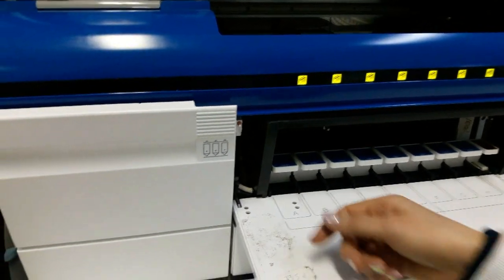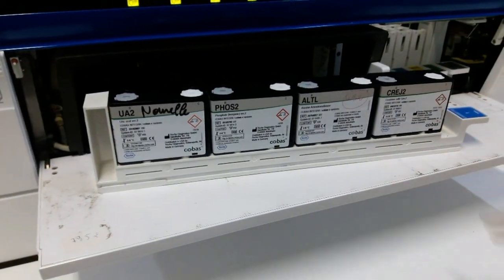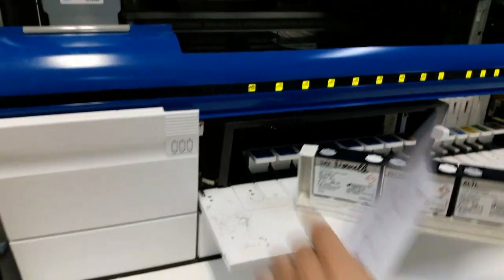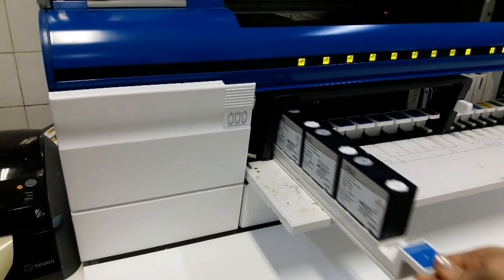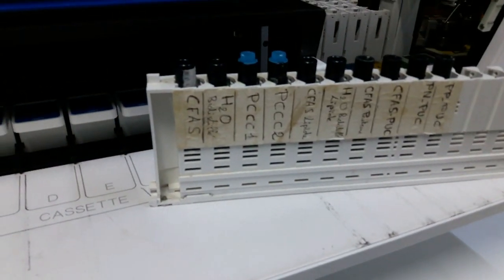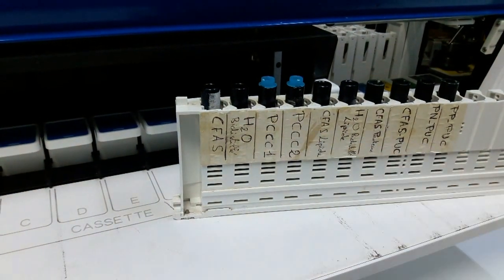Cette partie de l'appareil contient les racks des différents réactifs. Les racks se présentent ainsi. Par exemple, cette cassette est celle de la créatinine, ALAT, phosphore, acide urique. Le rack rouge est celui des calibrateurs et des contrôles. Par exemple, le CFAS, Calibrateur for Automated System. PCC1, le contrôle normal. PCC2, le contrôle pathologique.